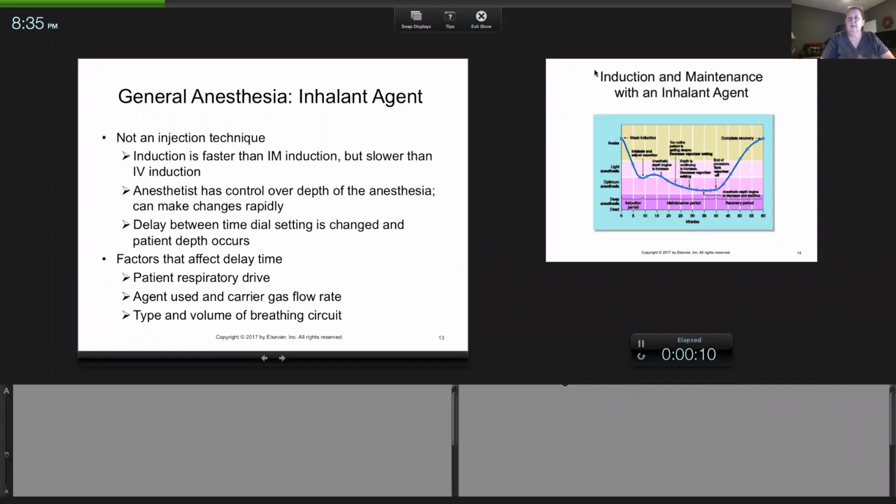Okay, well, yesterday's video left off with TIVA by CRI, which is an anesthesia that is done completely with injectable agents that you continuously give IV. The other way that we can induce anesthesia is to use an inhalant by itself. So this is not using an injection. If you get a dog out, you put them directly on a mask and you turn on the ISO or the sevoflurane and you give the inhalant and they inhale it until they fall asleep.